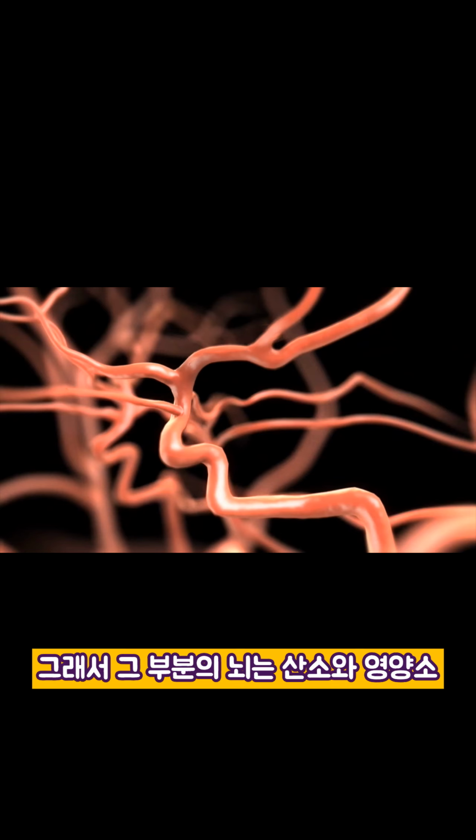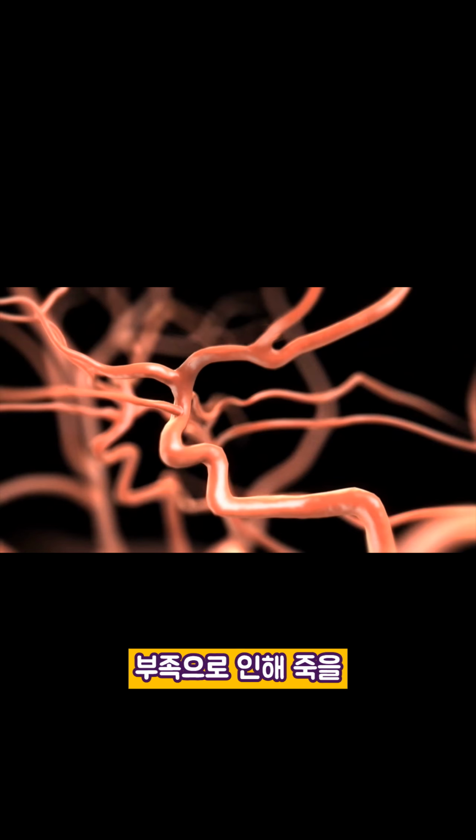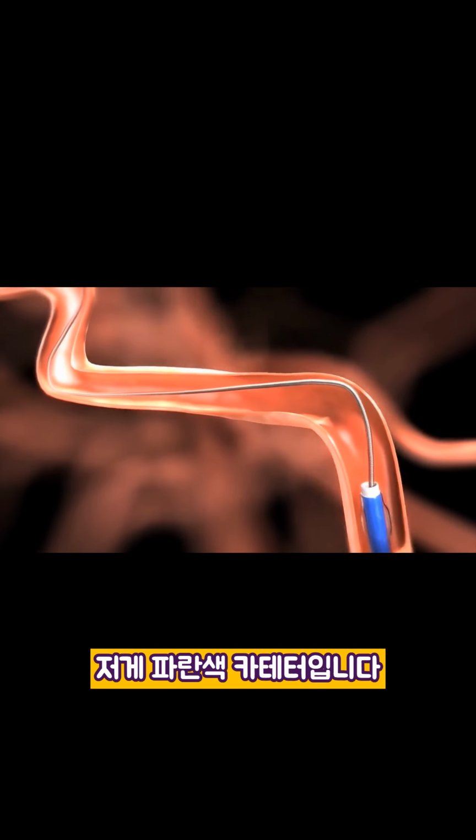So that part of the brain is at risk of dying because of the lack of oxygen and nutrients from the blockage of the blood flow. In situations like this, we can intervene. We can go in from the femoral artery in the leg with a catheter, as you can see here, and place it in the carotid artery in the neck. That's the blue catheter.